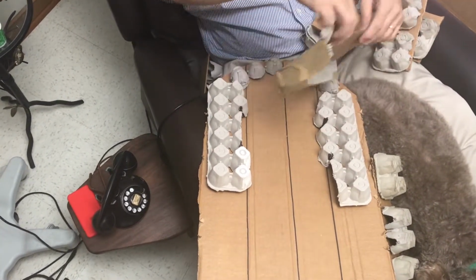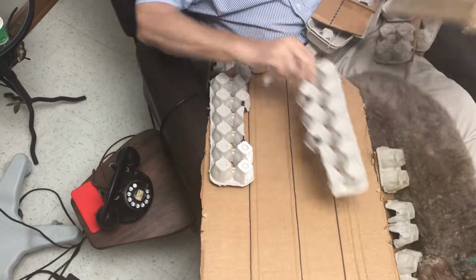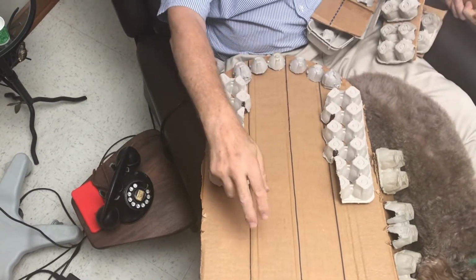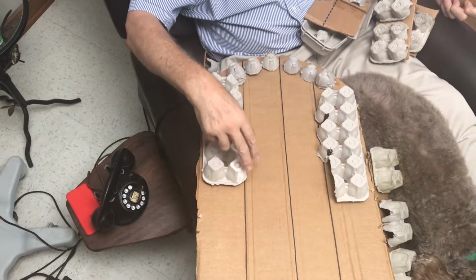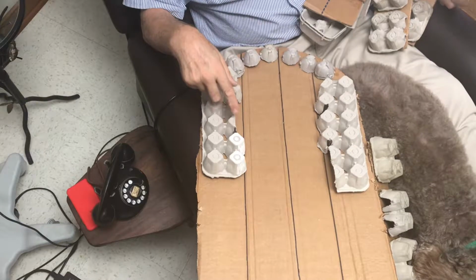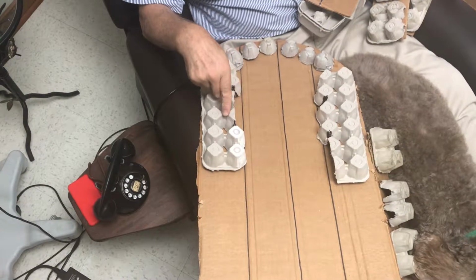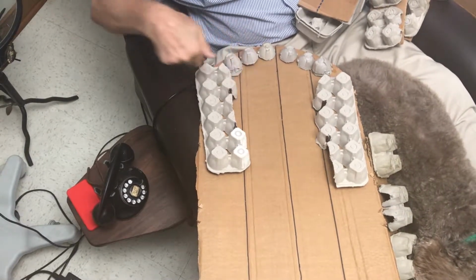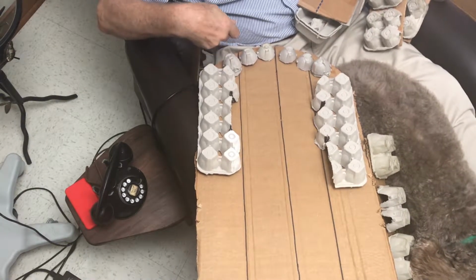Yes. It's too simple to say it looks like this, because we have to get that tongue out of the back of the throat. So as soon as it starts coming in, it hits the left side of the appliance, which is overly contoured, and then under contoured on the first molar, and at that point it will come up through that groove and start resting on the top again.